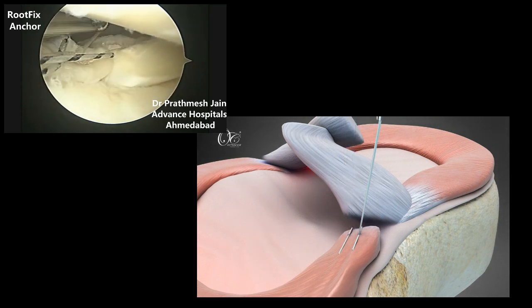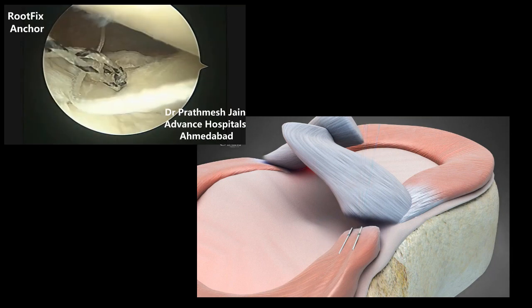Finally, cut the zero-number fiber with the OsteoCare CV Form Suture Cutter, leaving a low-profile knot over the meniscus.